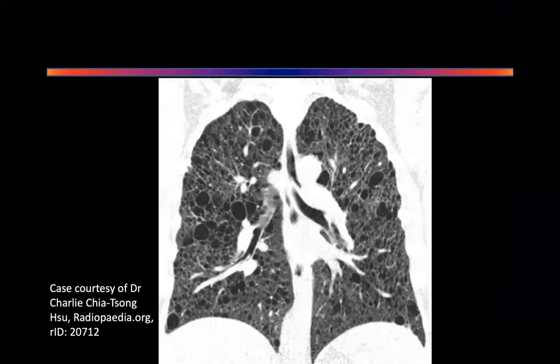Sir, there are multiple cysts in both the lungs, sir. One minute, Vishwarup. Can I stop you for a second? Is there anything wrong with this picture? Not the pathology of the thing, but the picture itself. Is there something more you wanted before you started talking? Sir, I cannot see the heart shadow and I don't know. I mean, maybe.